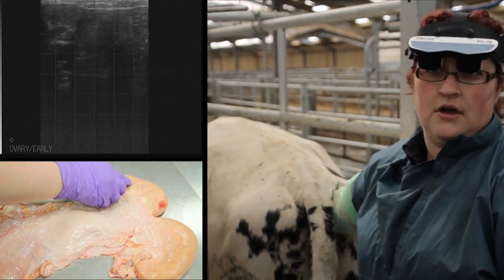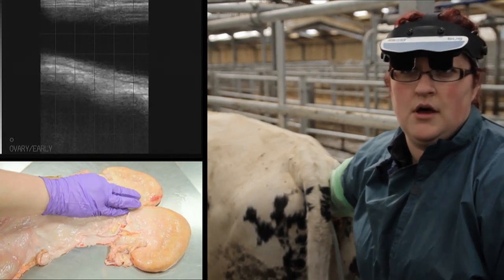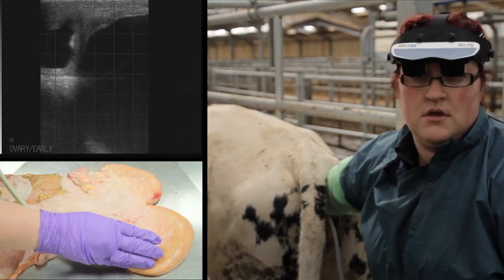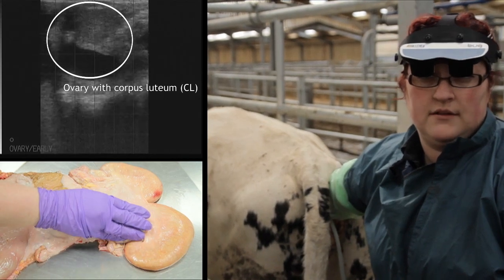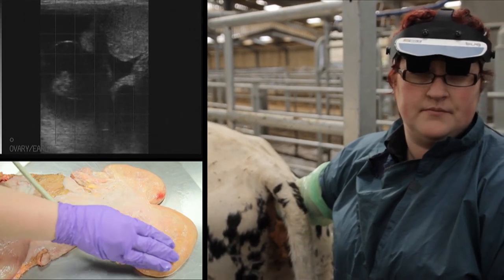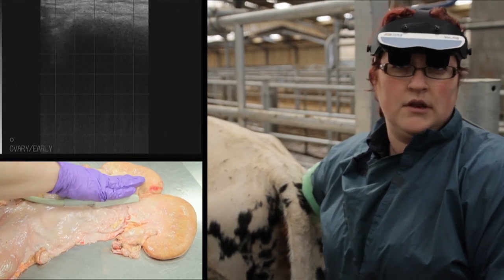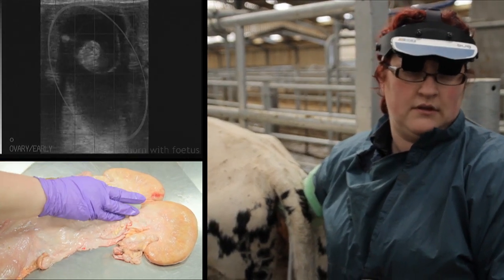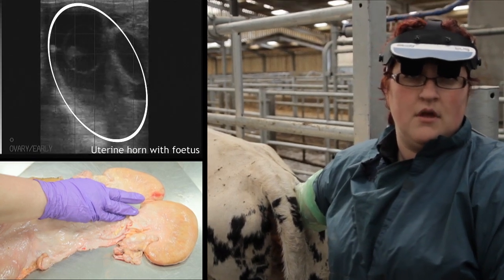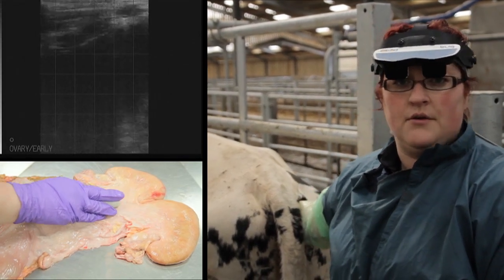We can then come back down that horn to the body of the uterus, travel up the opposite horn, evaluate the ovary on that side, and then come back to the body. If there are any other structures that we want to visualize within this cow, then we can do that at this time. Once we've seen everything that we need to see, we can then gently come out of the cow.